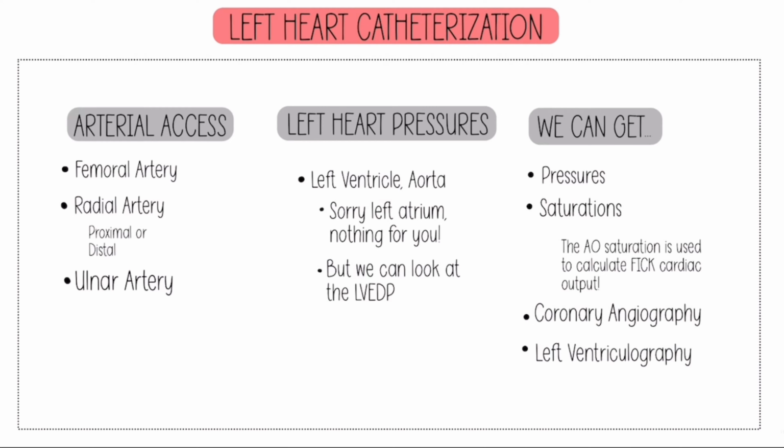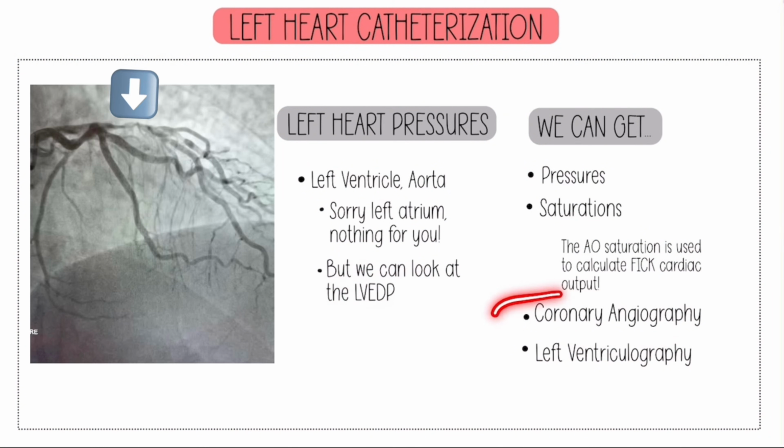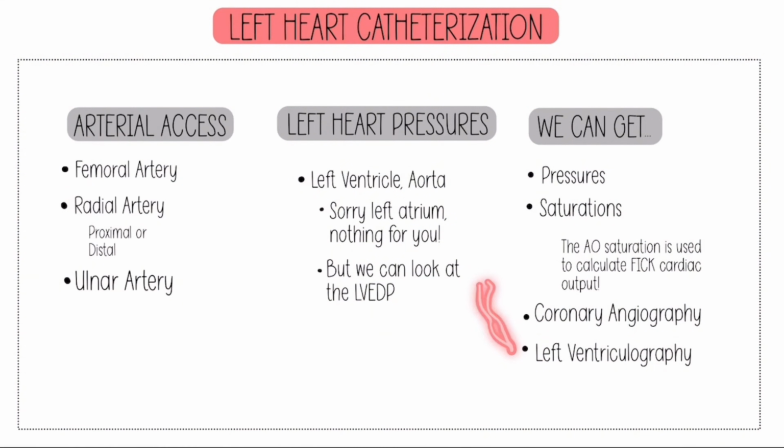And you could correlate something weird with the LV-gram that you found in their echo, and you could correlate that to if their LV-EDP is increased. And then when you look at the coronary angiography and you say, oh yeah, they have disease in their LAD, and I saw that the anterior wall was moving really slowly. That also came up on the echo, and I see the LV-EDP is 20, which is elevated. Then you could attribute all of those things to the coronary disease that you found in the LAD, and you could say, okay, we're proceeding to fix this because I think that's the reason for their symptoms, as well as the findings that we found on both the non-invasive and the rest of the invasive testing. So that's kind of how everything rolls together.